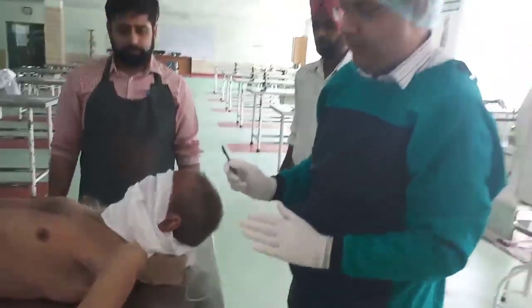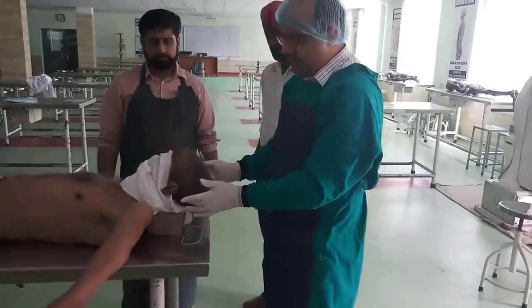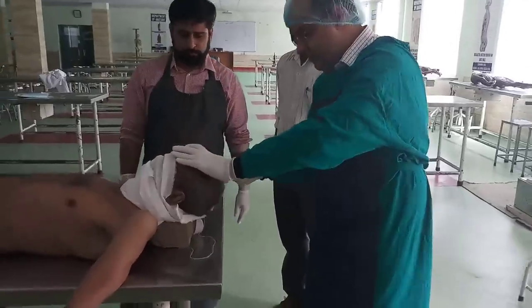Today I am going to demonstrate the steps of opening of the skull. We will start with the scalp dissection. For that, an incision is given from one mastoid process to the other mastoid process over the vertex. So I am giving the first incision.